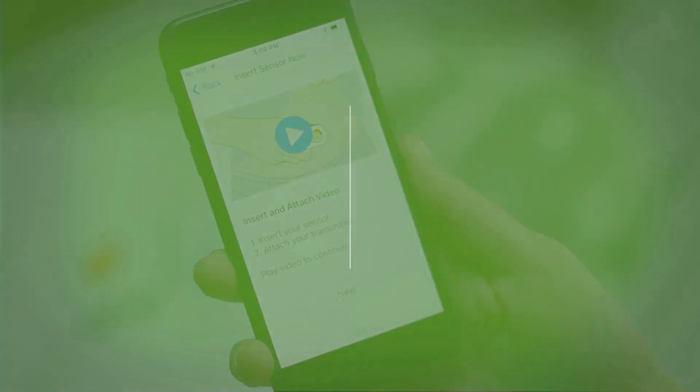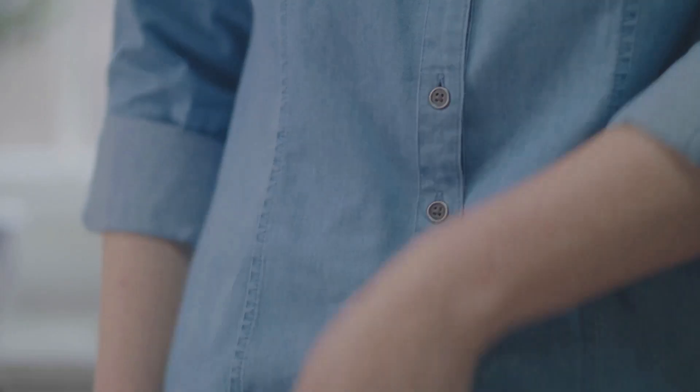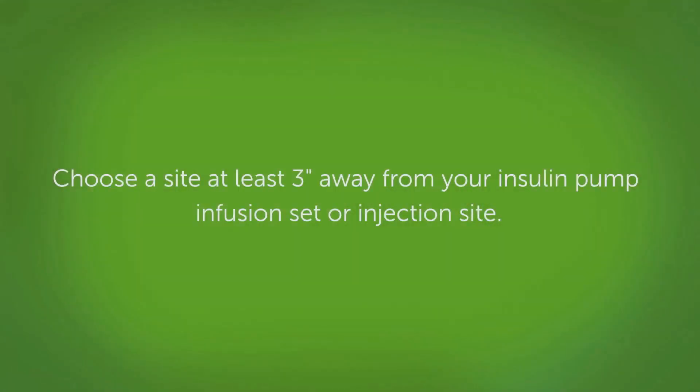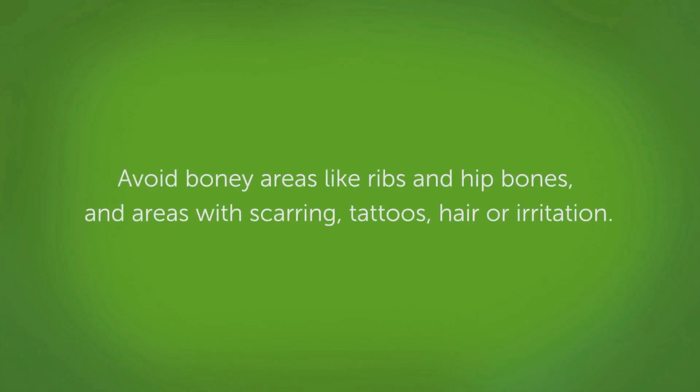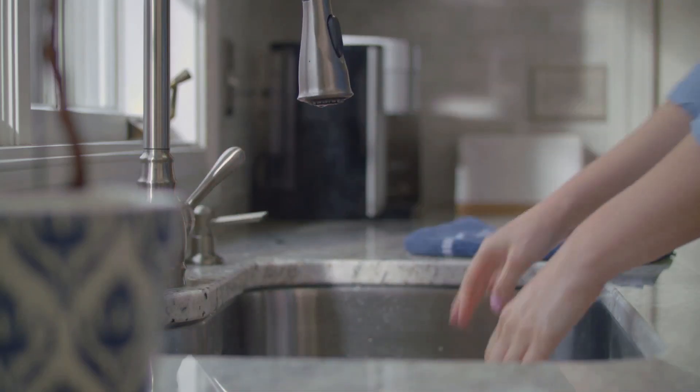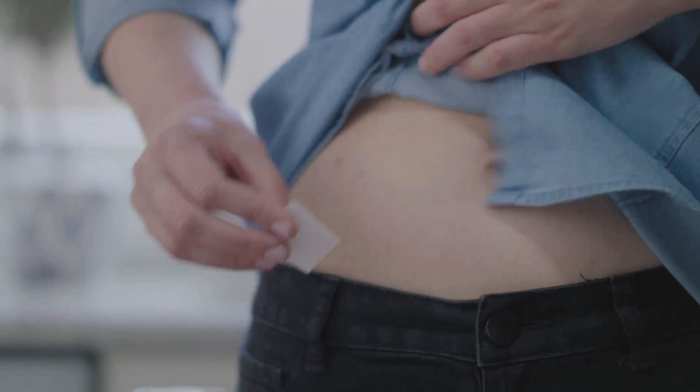Now, you'll need to insert your sensor and attach your transmitter. To insert your sensor, first choose a place on your abdomen. If you are under 18, you have the option to place it on your upper buttocks as well. Choose a site at least three inches away from your insulin pump infusion set or injection site. Avoid bony areas like ribs and hip bones, and areas with scarring, tattoos, hair, or irritation. First, wash and dry your hands.